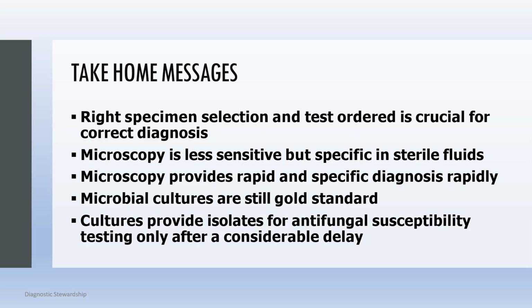That was about the principles of diagnostic tests for infectious diseases. The take-home message is that right specimen collection and test order is crucial for correct diagnosis. Microscopy is less sensitive but specific in sterile fluids. Microscopy provides rapid diagnosis. Microbial cultures are still the gold standard, and culture provides isolates for antimicrobial sensitivity testing, but only after considerable delay.